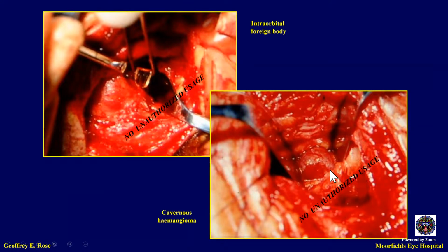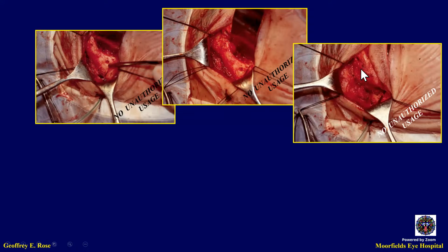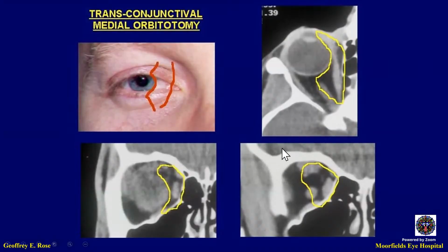Open that, do whatever is necessary in the orbit. And then, because you haven't taken the bone out, it's just been hinged outwards, we just swing it back in, and you then close that area or secure it with some 5-0 or 4-0 Vicryl soluble sutures. I have no financial interests in what you use, but you don't need bone plates and so on. It just swings back because it's held by temporalis. Close the periosteum over it if there is periosteum, close the deep layer here, and then just a running suture in the skin. You don't need any deep sutures in the rest of the skin crease. It's only lateral to the lateral canthus you need deep sutures, and it heals extremely well.